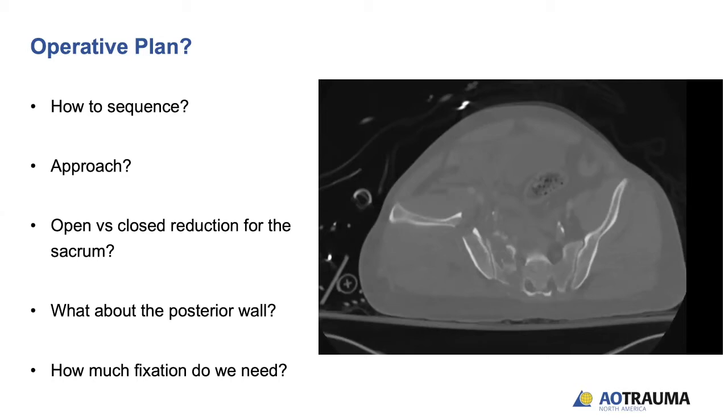The rami aren't really going to come into play if you set your sacrum, go ilioinguinal, put your anterior column in place, and then you're going to have a challenge if you're off with the posterior column component, especially with that wall trying to key it in. And I think that's where your challenge will be.